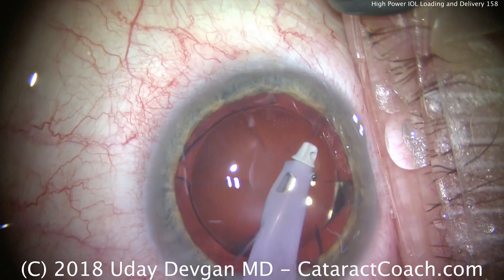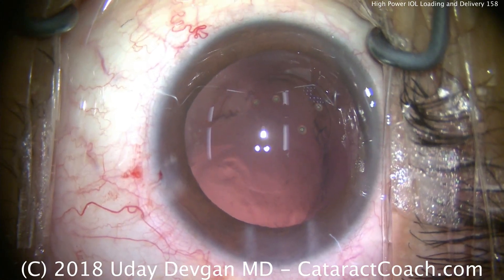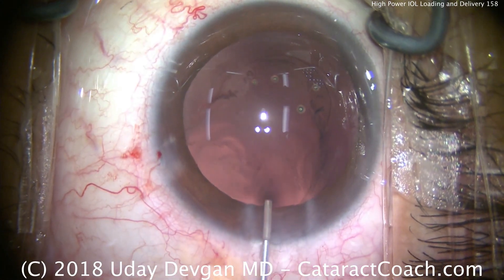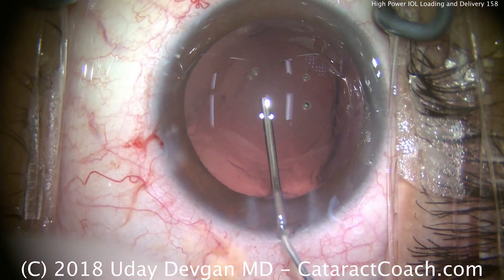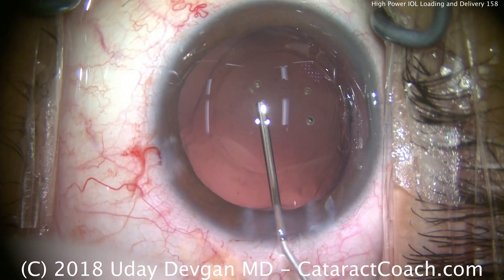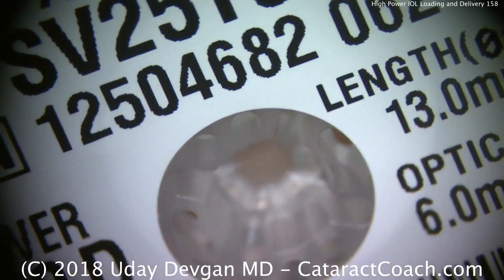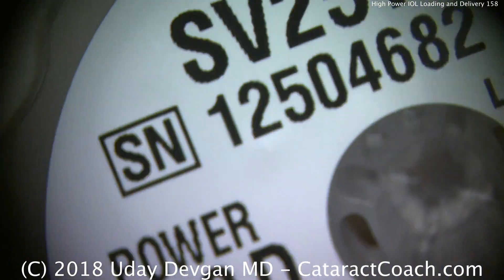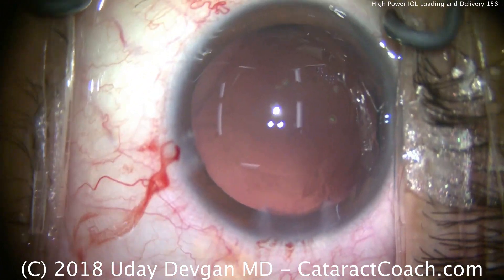Let's look at the next example. This patient is going to get a 29 diopter lens. We'll fill the capsular bag with viscoelastic. The lens is a 29 diopter multifocal with a 2.5 diopter add at the optical plane, which means at the spectacle plane it's only about two diopters.